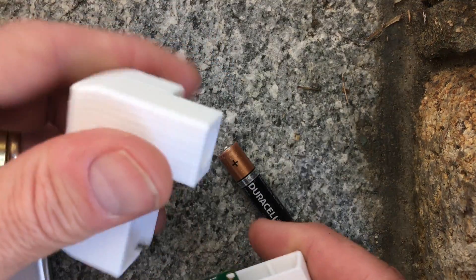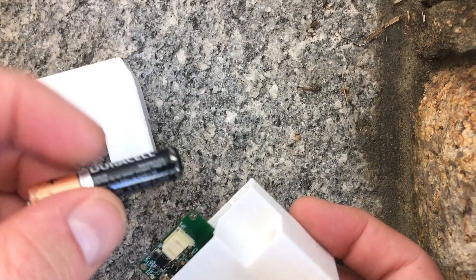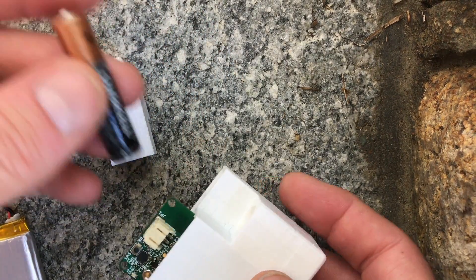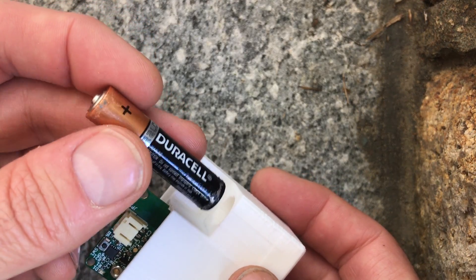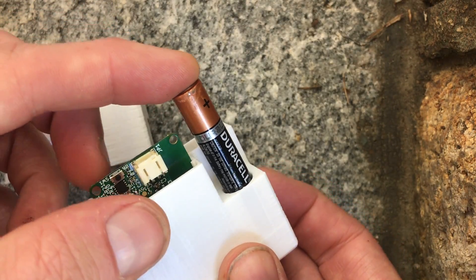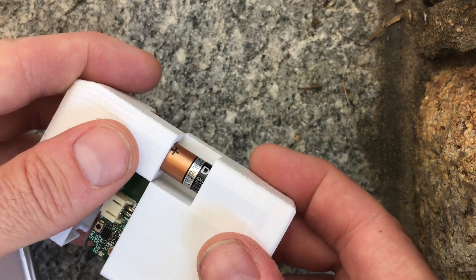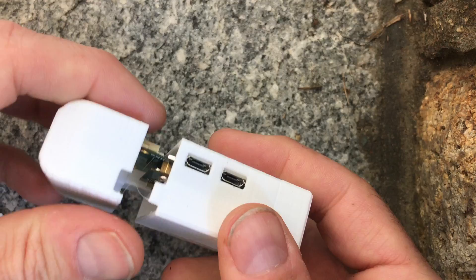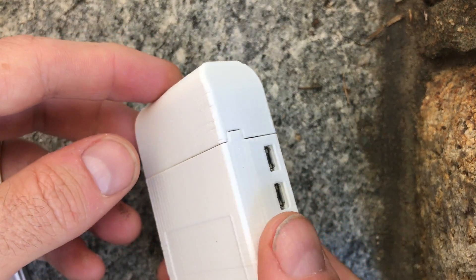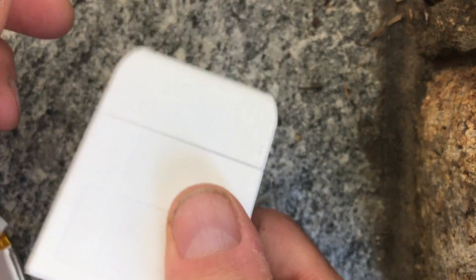Now this is the top and it doesn't just stay on by itself — it needs this battery. The purpose of this battery, aside from holding the cover on, is that the Medtronic pump battery may only last three days for an alkaline, so carrying a spare is a really good idea. That just fits in there and the battery holds it together, so it snaps together nicely and it won't fall off.